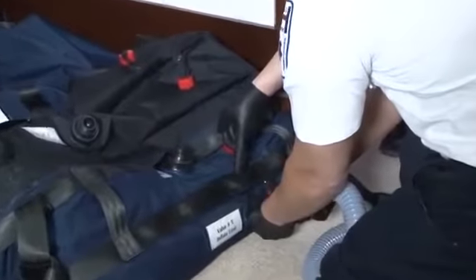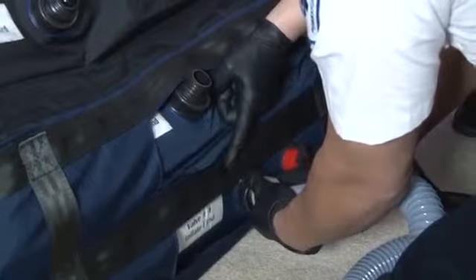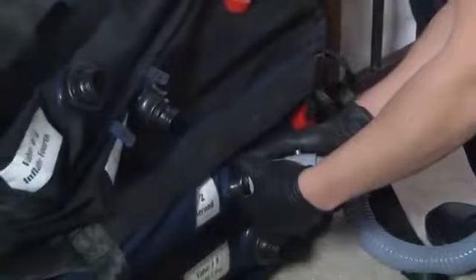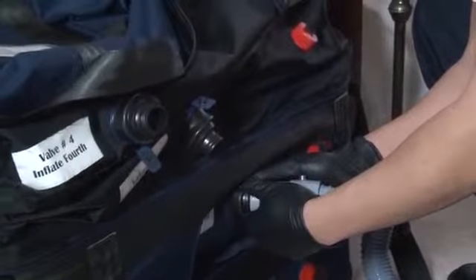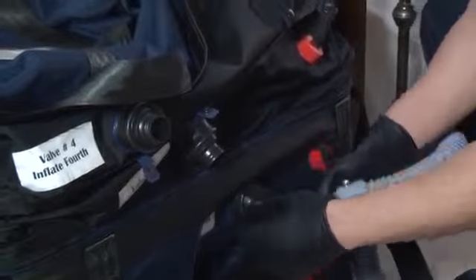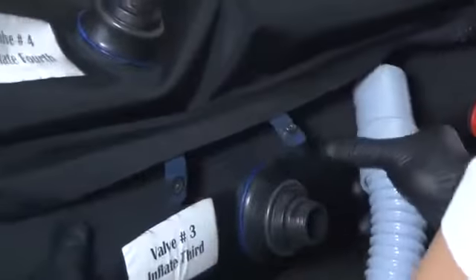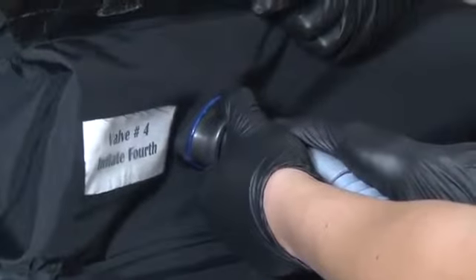There is no risk of overinflating the Evacuation HoverJack 2, but underinflating chambers could lead to a potential safety risk. Always be sure each chamber is completely filled before moving on to the next chamber. When you have determined that the first chamber is fully inflated, move the air hose to the valve in the second chamber, labeled valve number 2, and repeat the look, listen, and feel technique until fully inflated. Continue the same process for air chamber valves labeled 3 and 4. Once all chambers are inflated, press the power button on the air supply to stop the flow of air.